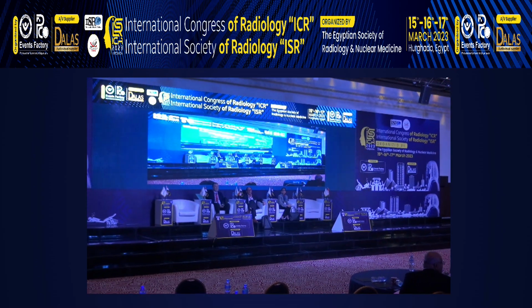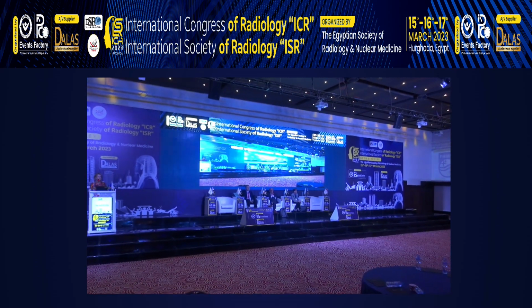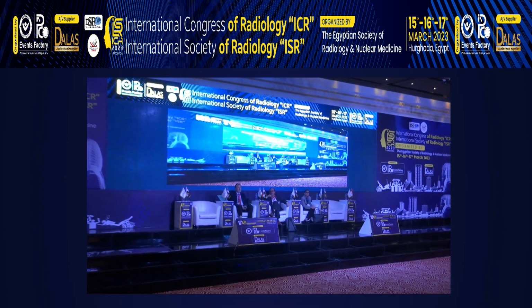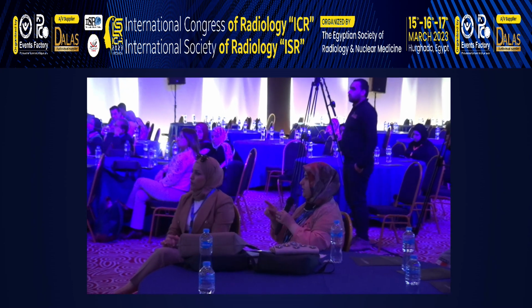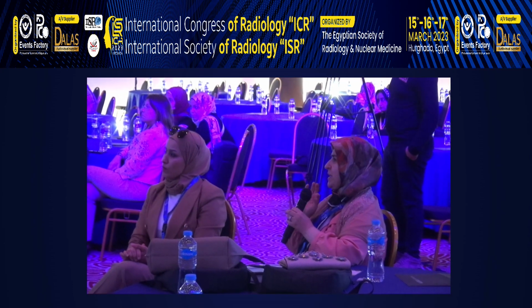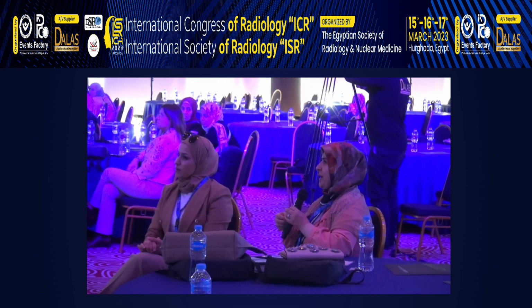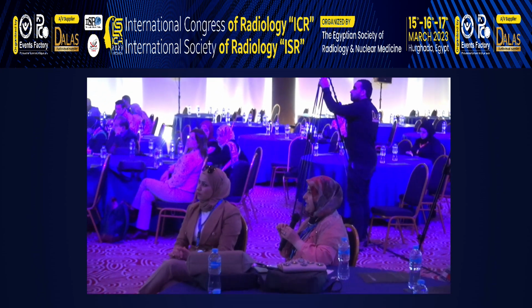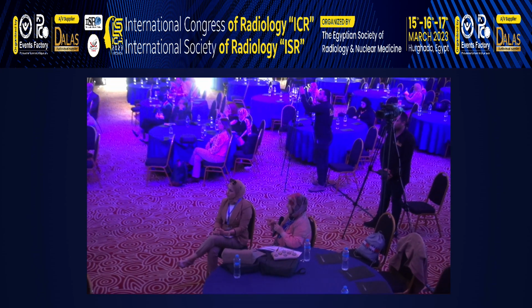Thanks a lot. I have 2 questions. One is also for Professor Bello concerning the case with hemorrhagic infarct, sinus thrombosis. You rely on gradient recall echo, GRE, and it was bright, the vein was bright, but actually what we have learned also is that it's usually dark on GRE, the sinus when it's thrombosed. But here it was bright.